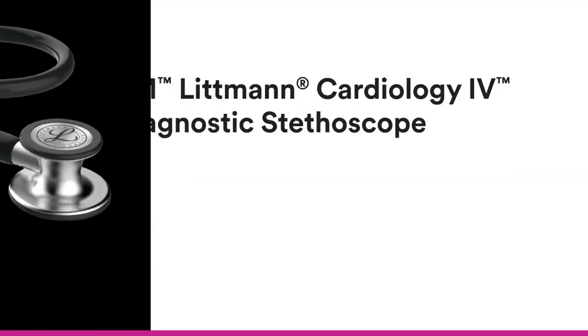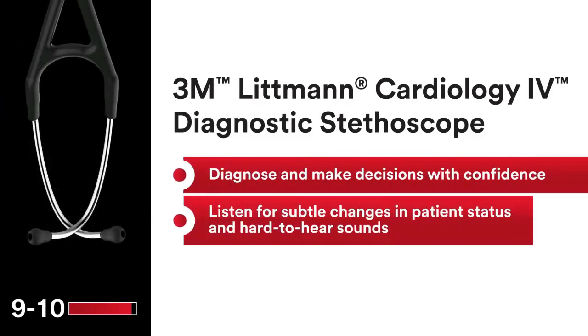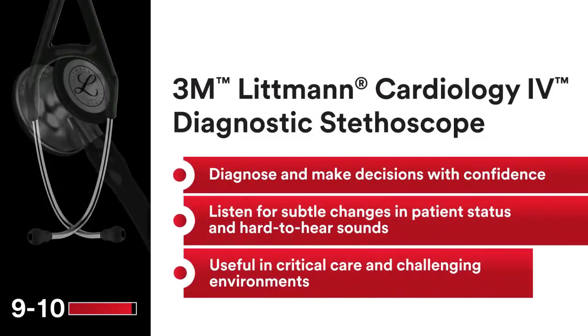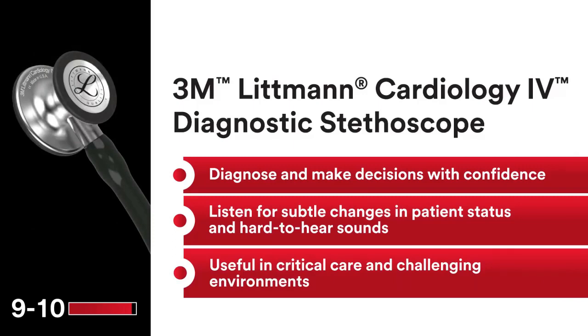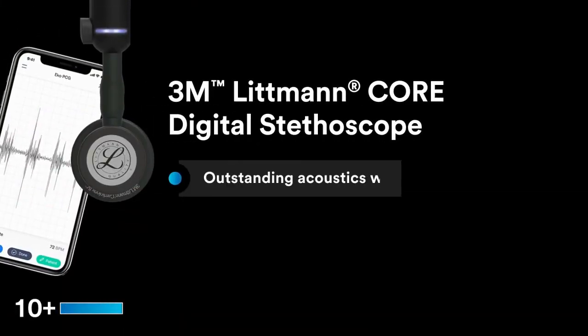7-year warranty. Ergonomic and high-profile construction — 40% larger chest piece and 60% deeper bell than the 3M Littmann Classic 3 Stethoscope. Designed for use with adult and pediatric patients. Tunable, dual-sided stainless steel chest piece with open or closed bell.